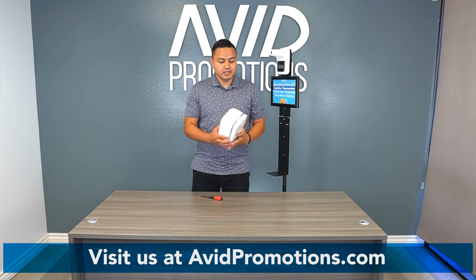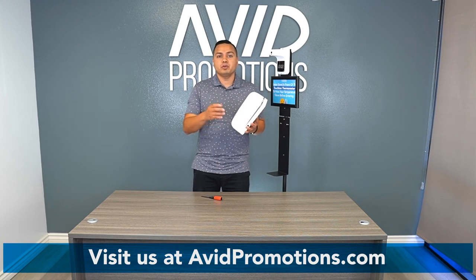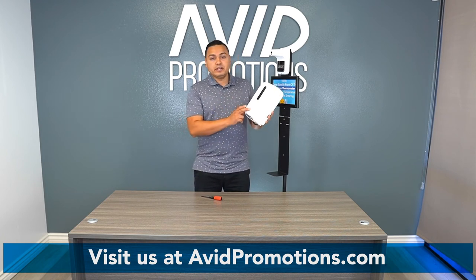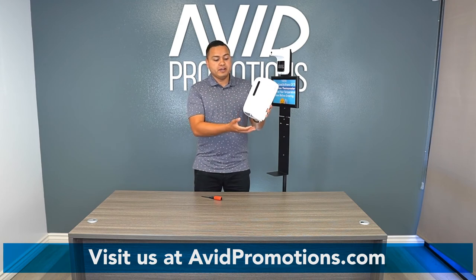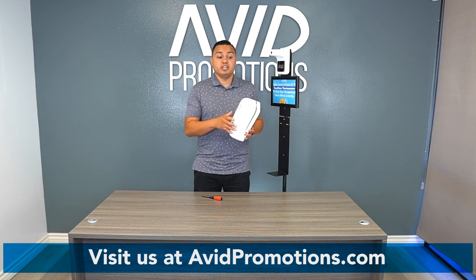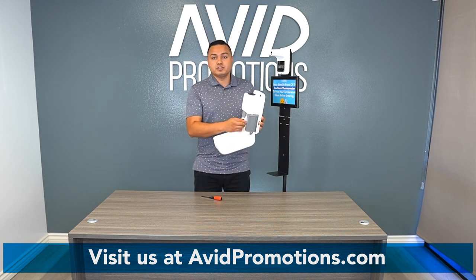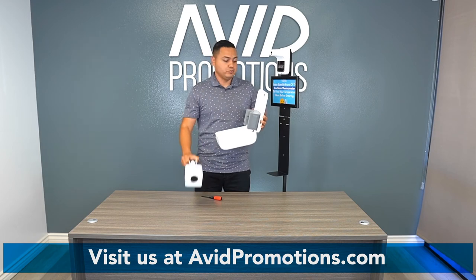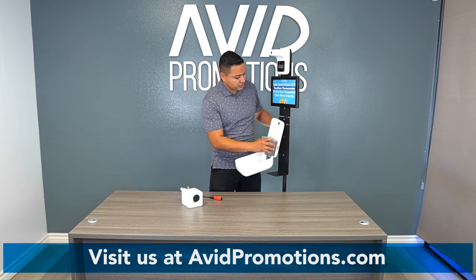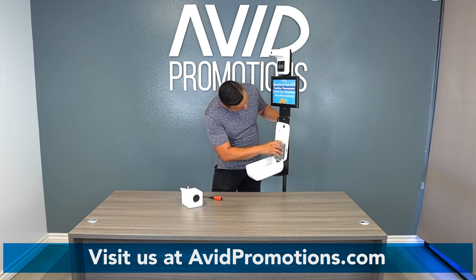Next up is your dispenser. The dispenser itself is touchless — it runs with either batteries or a power cord. If you're interested in the power cord option, please send us an email and we'll discuss it. You put your hand down there and it senses it, dispensing liquid. To set it up, remove the master card. As mentioned, you put your screws on the stand beforehand, and then slide the dispenser right in.